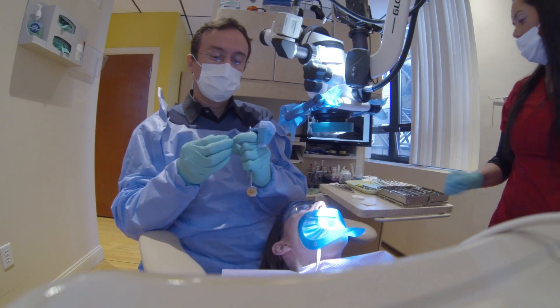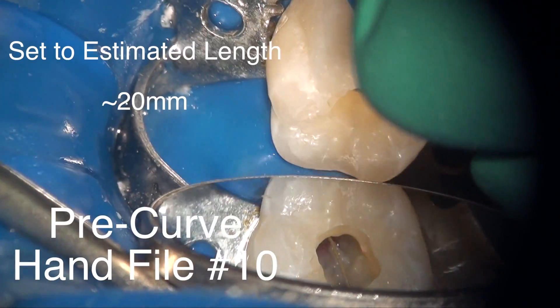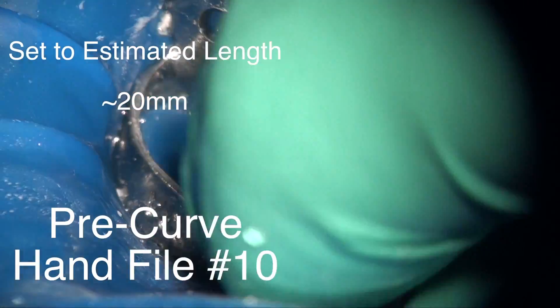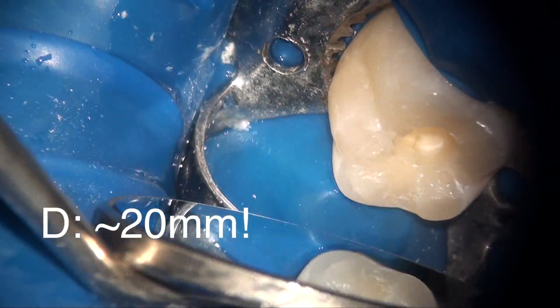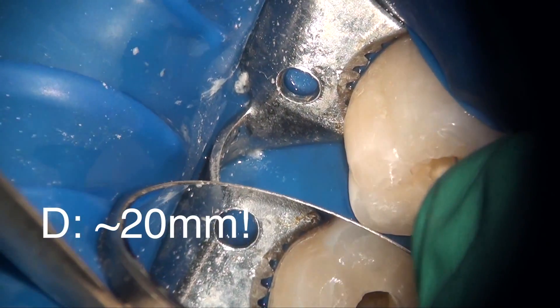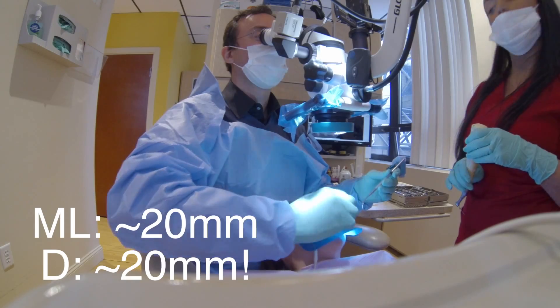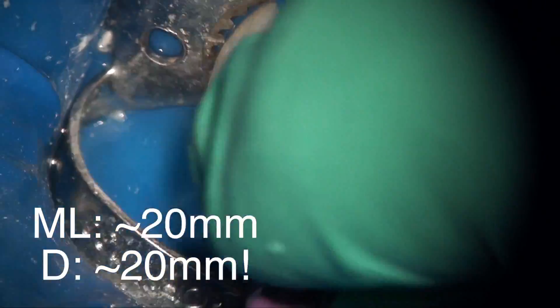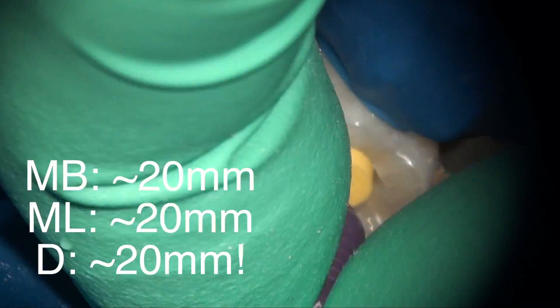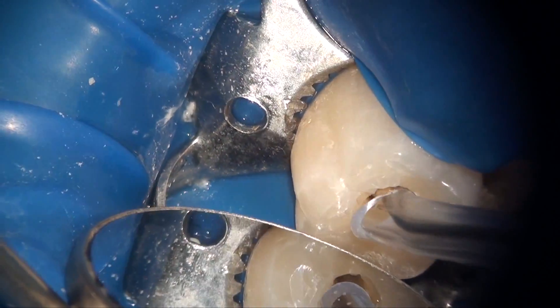I'm pre-curving my first hand files — a size 10 hand file — going by an estimated length of 20 millimeters. I'm not trying to go all the way down to get a working length, but based on the pre-measurement from the radiograph I was expecting somewhere between 20 to 22 millimeters. In this fairly straightforward case, the size 10 does go down to about 20 millimeters, confirming that I have 20 millimeters of space available for instrumentation.